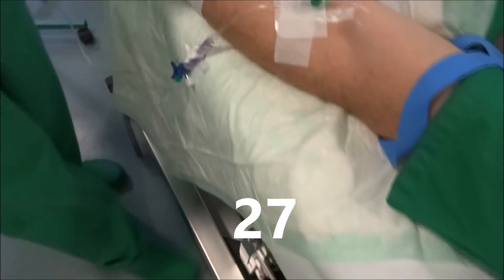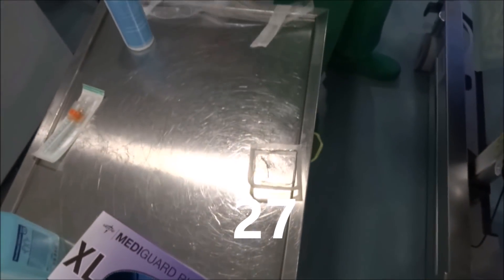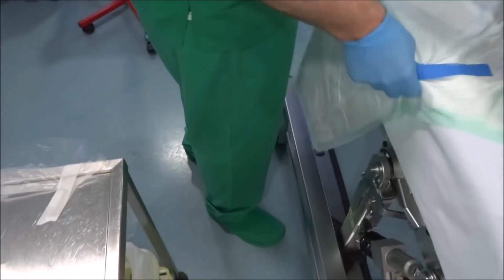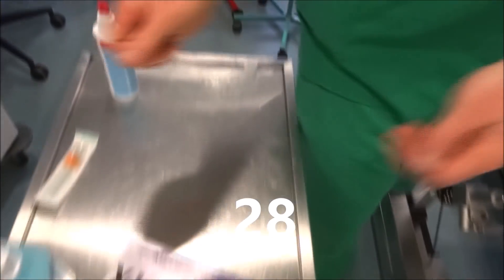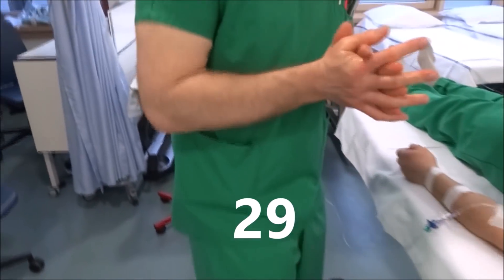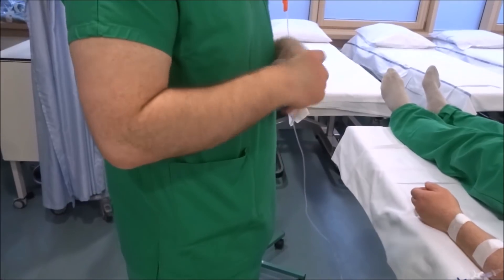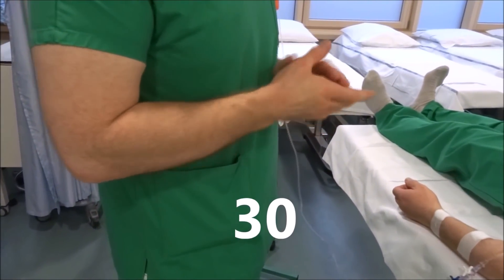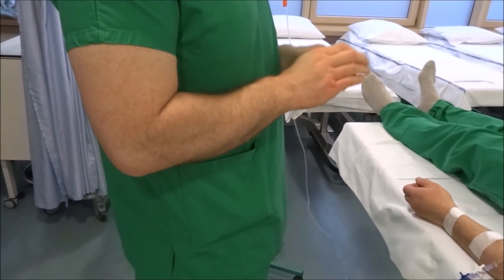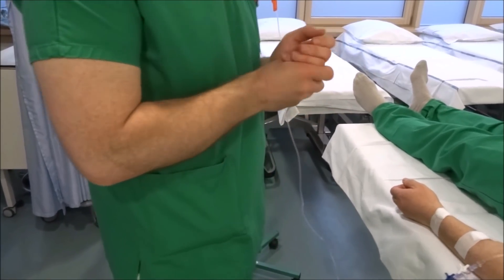We dispose of all waste, take off the gloves and dispose of them too. Thereafter, we again perform a hand disinfection. We inform the patient about any signs of complications and that they need to inform the nursing staff immediately. Last but not least, we document our measures in the medical file — that is our standard practice to start an IV.